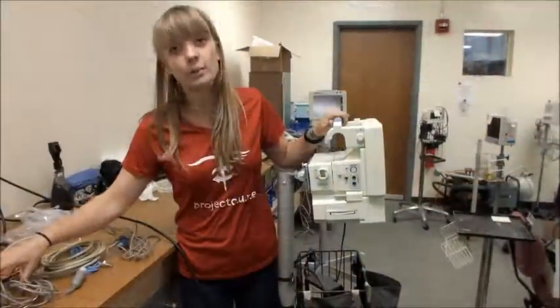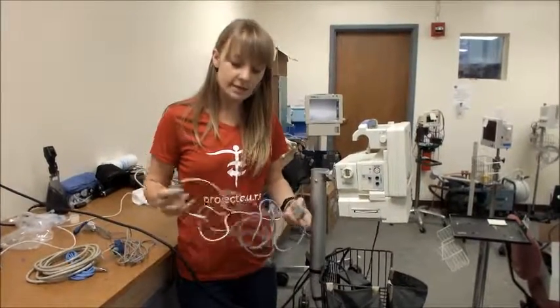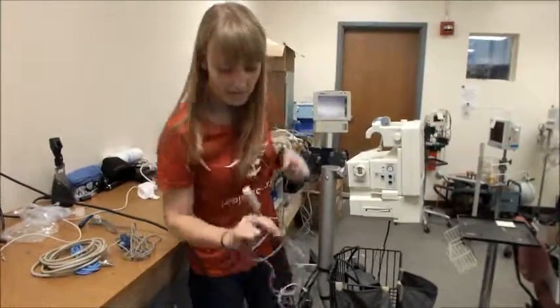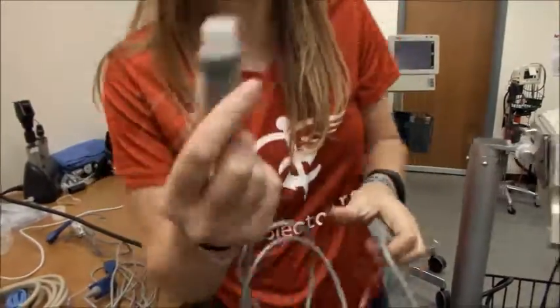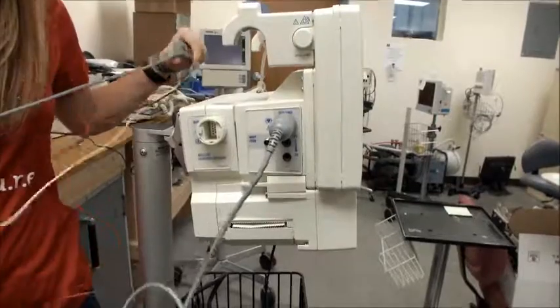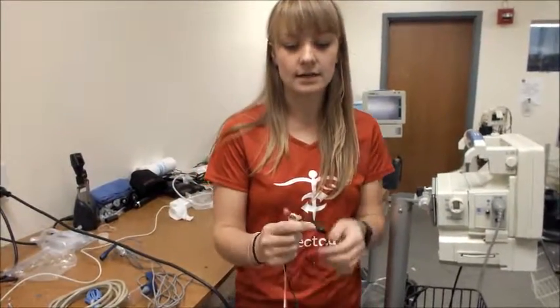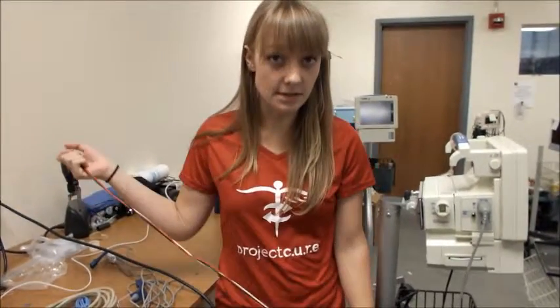Now that we've found where our cords are, we're going to double check that the connections work. This is our EKG cord. The attachment to the machine has six prongs, just like the connection, so it should plug in right here. The EKG cord typically has three to five electrodes on it — one black, one red, and one white. If it has five electrodes, that's also okay, but you can only test the machine with three or five electrodes on the cord.